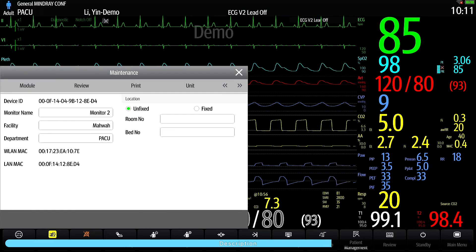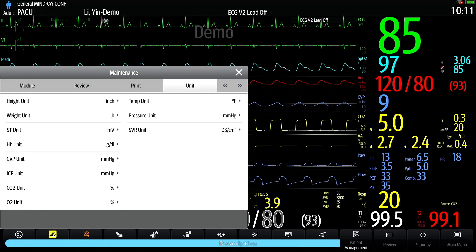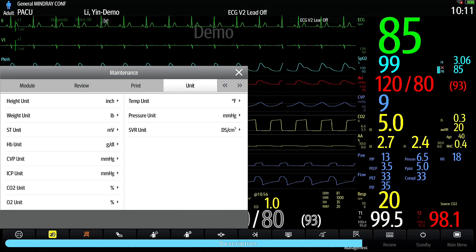Here you will be able to change your unit of measurement for all of the available parameters.